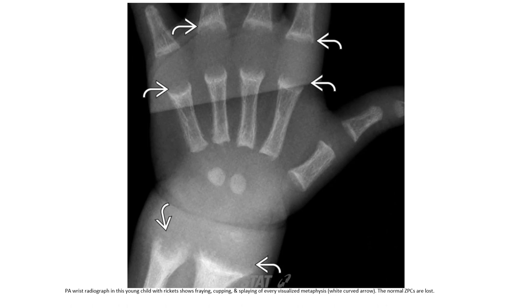AP knee radiographs in this young child with rickets show fraying, cupping, and splaying of the distal femoral and proximal tibial metaphyses, which have lost their zone of provisional calcification.